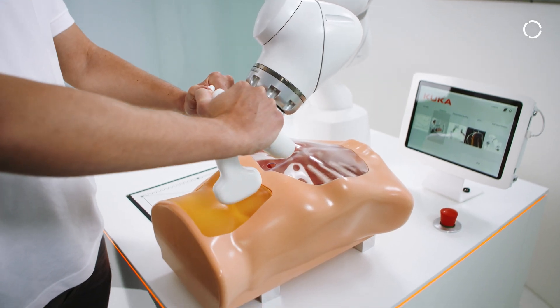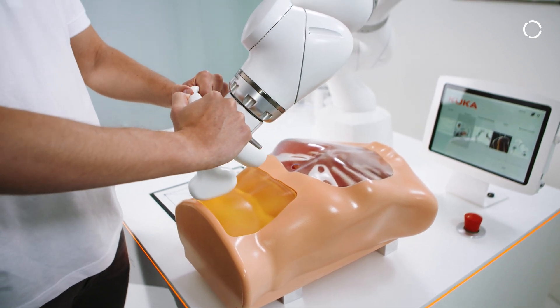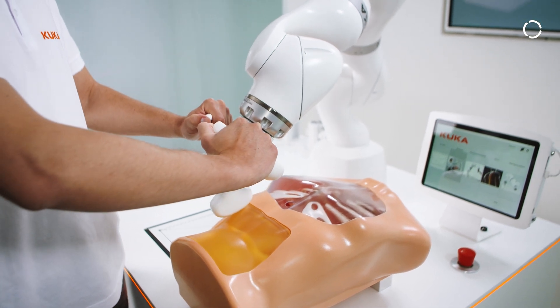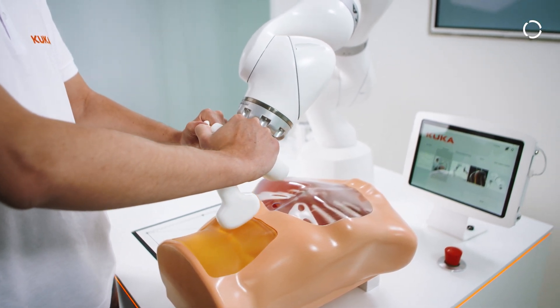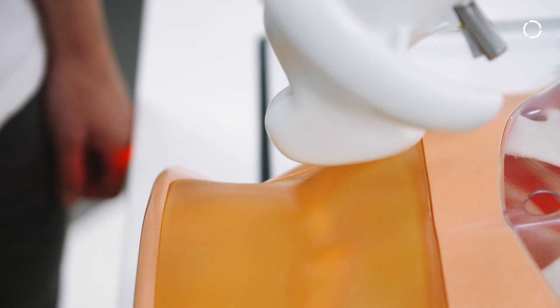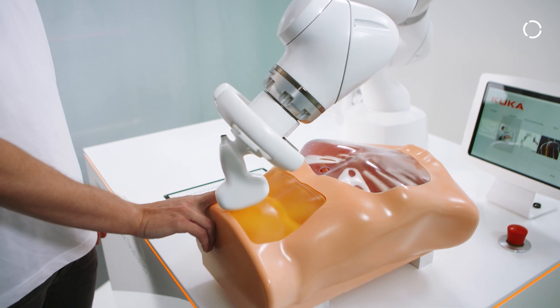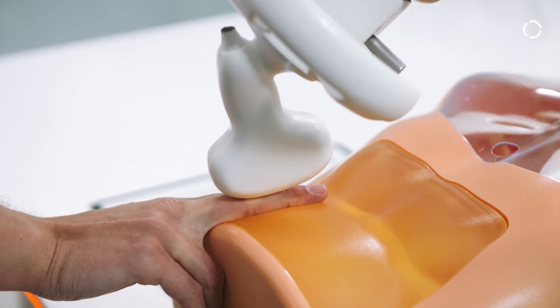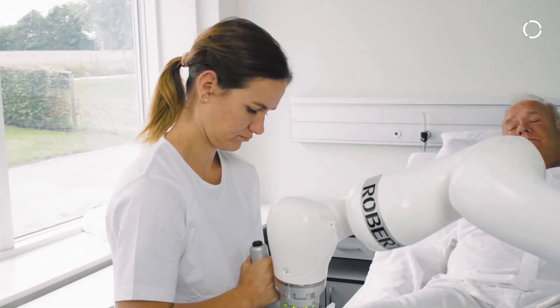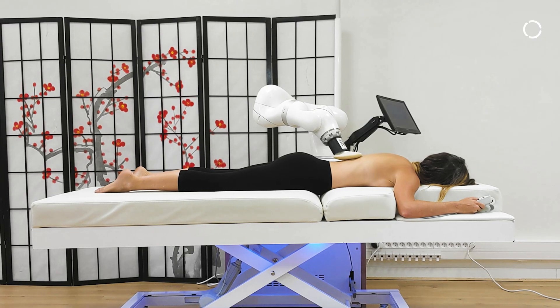In this example, while the robot is being hand guided by the user, it records their trajectory which can later be replicated. A smooth motion without geometric constraints allows the teaching of custom trajectories. While replicating the motion, the robot applies a pre-programmed force on the surface. Examples of applications of the motion teaching include rehabilitation or massage.